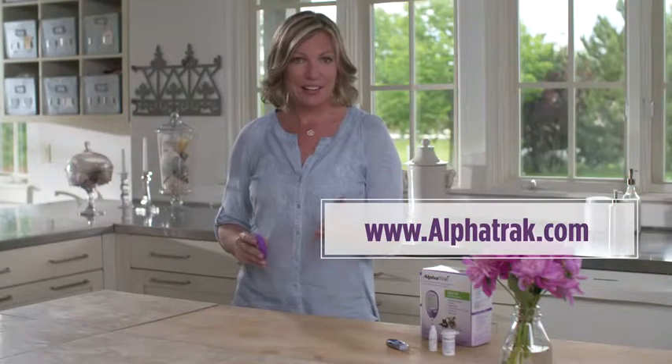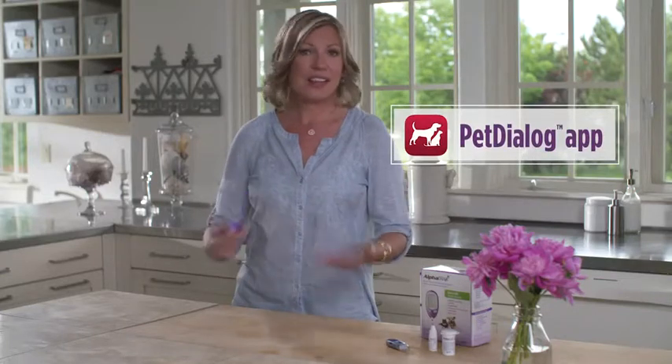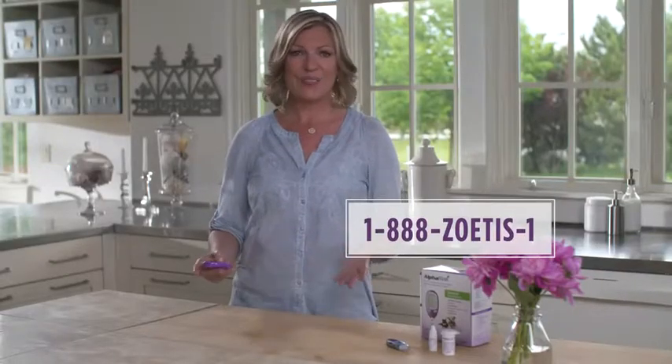Before we get started, it's a good idea to register your product. You can do that at alphatrak.com. You can also download the PetDialog app, which allows you to track readings, create insulin reminders, and send data to your veterinarian. It is a really helpful tool, and I highly recommend you get it — and it's free. Finally, if you have any questions, you can call this number and get live, one-on-one assistance.